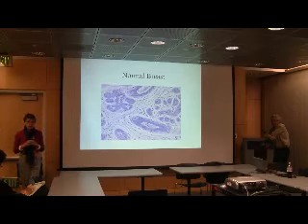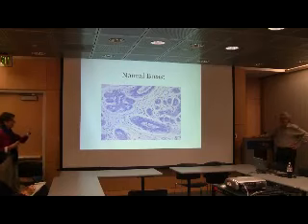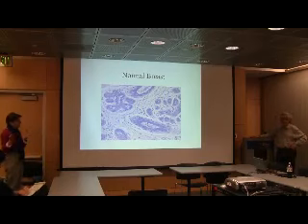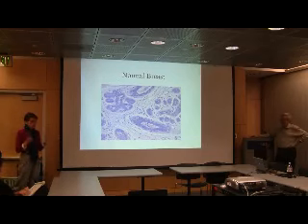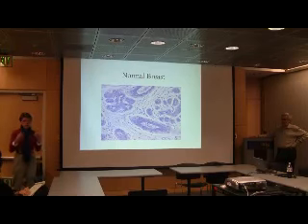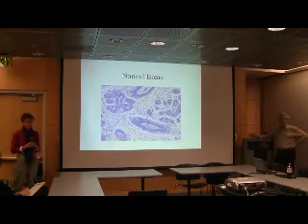That's something that we expect to see. When I look at a slide, I don't even think about it, and it's good that you brought it up, because I'm so used to this artifact. When we look at tissue, we really are looking at a bunch of artifacts that we have learned what they mean. They're really all reproducible artifacts.